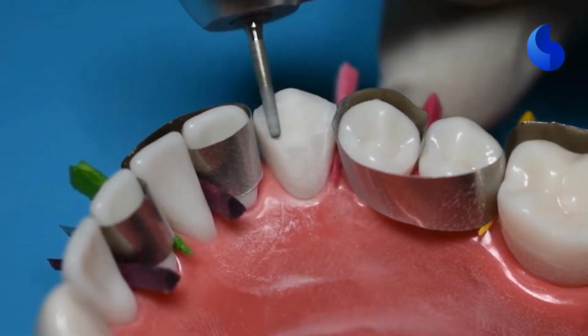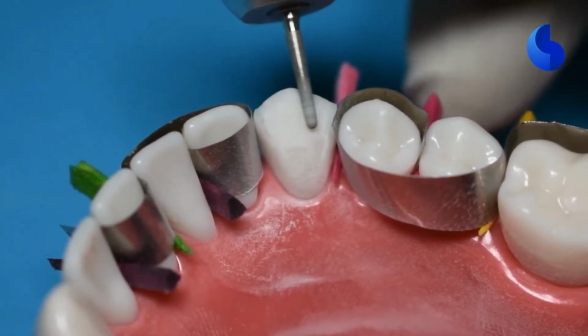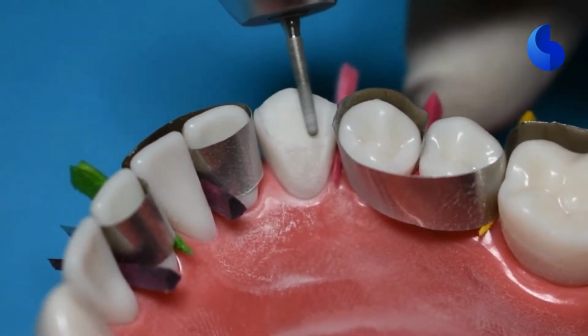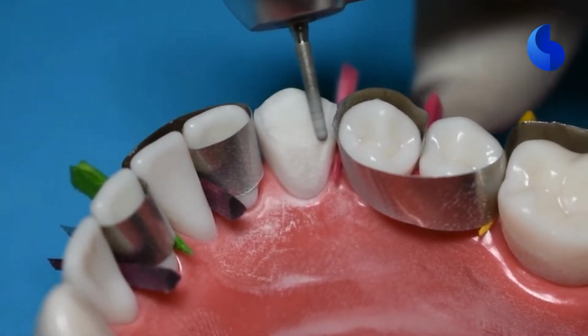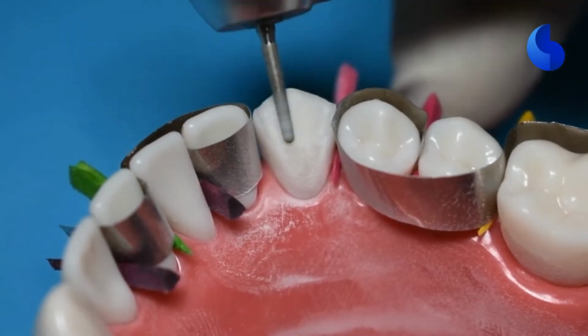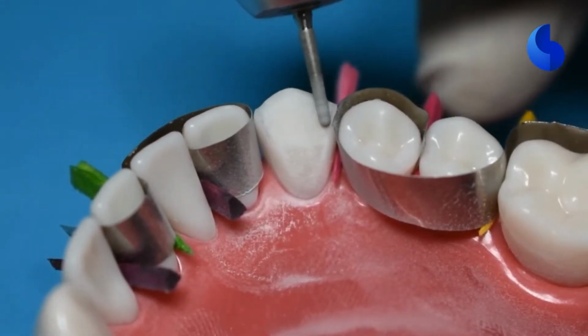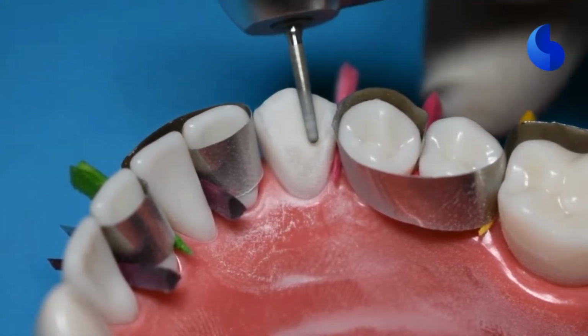The best way to do it is to follow the long axis of the tooth and continue to reduce going further and further down. This is not your entire lingual reduction, but this is to give you a start so that you have the sufficient bulk that is required, and you'll later be increasing it when you're placing your lingual reduction as well.